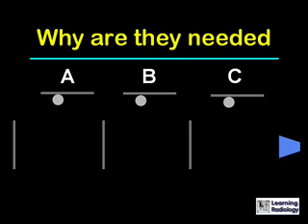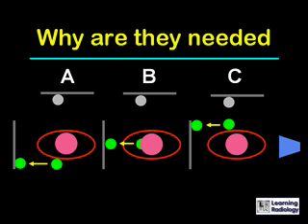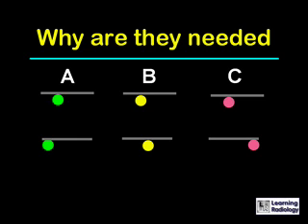And so we'll add another view at 90 degrees to the first, an orthogonal view represented by the vertical gray stripes. And in the case of patient A, we can see that the lesion is projected in that location on the X-ray cassette. Patient B, it's projected in that location, and patient C, it's projected in a different location. Now, if we take the two pair of images, the frontal and lateral, for patient A, for B, and for C, and we look at them together, as we usually do, it is relatively easy to localize where the lesion is.